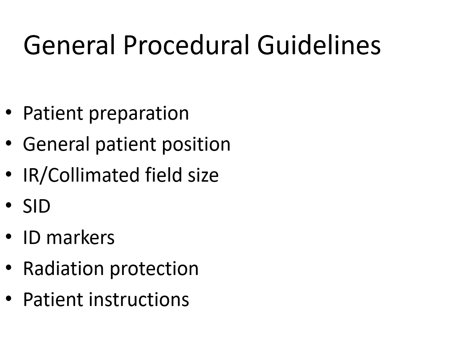There is going to be motion artifact if you allow the patient to breathe during the exposures. Now, we do want that for the swimmer's projection. We can use a breathing technique, kind of like what we did, I think it was the sternum or maybe the transthoracic lateral, where a breathing technique was utilized or recommended. You can use a breathing technique for the swimmer's projection as well.